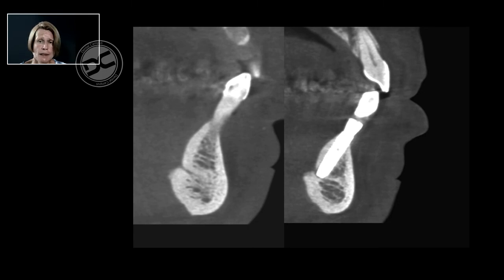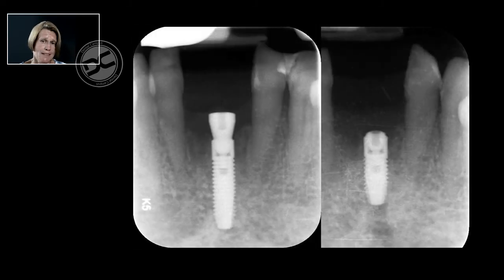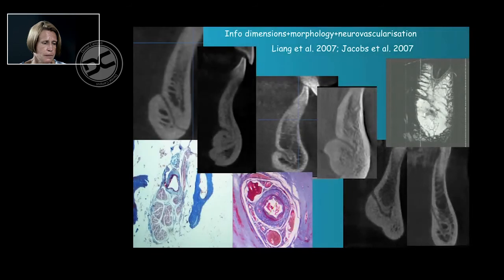And thus, when an implant is placed on that, either an indirect trauma by hematoma formation or a direct trauma to the nerve may occur. In this case, we have actually thus removed the implant in the first few days after the surgery to then allow placement of a smaller implant, and the problems disappeared.